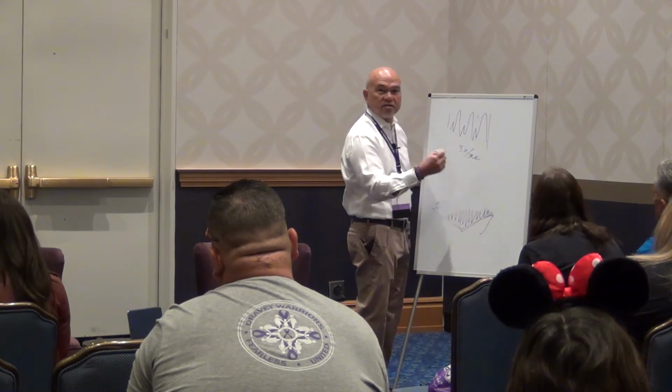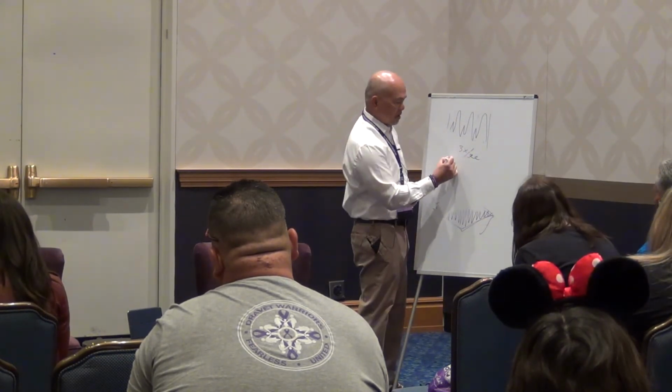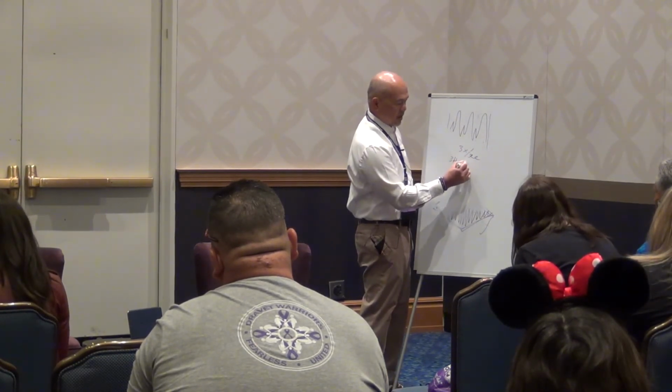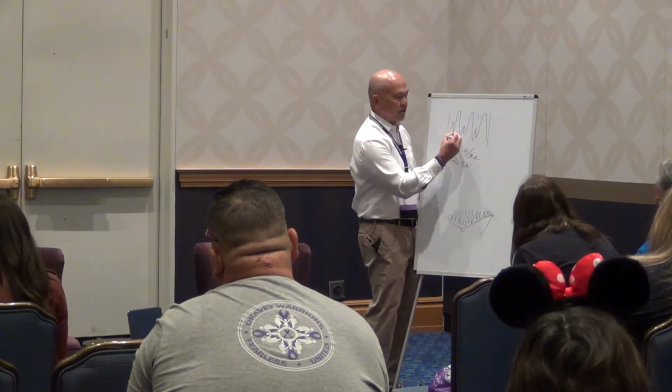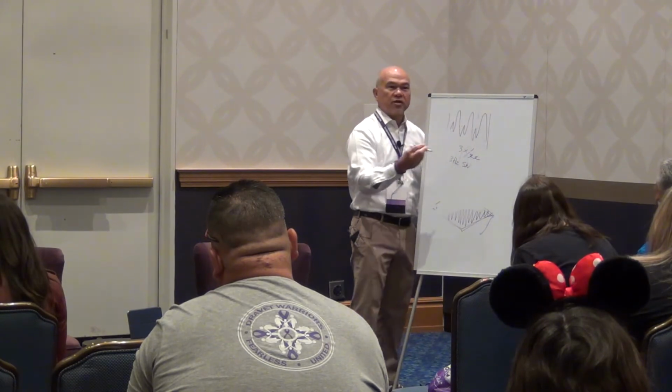So that's the signature of absence: 3 hertz spike and wave discharge. If you actually watch one having a seizure, they blink. Their blink is 3 per second. It's time locked to the spike and wave.